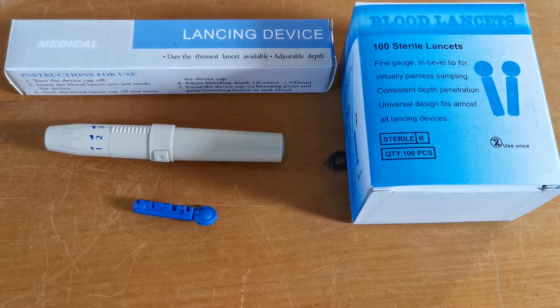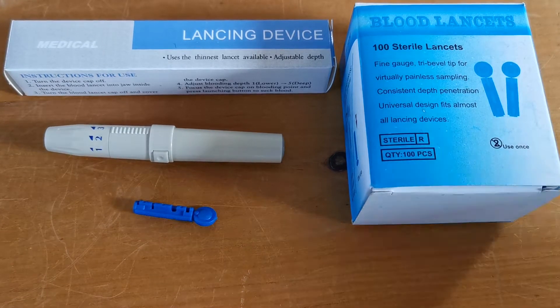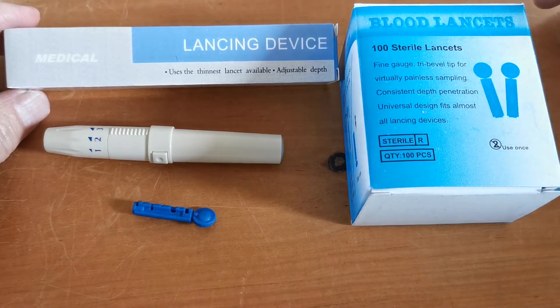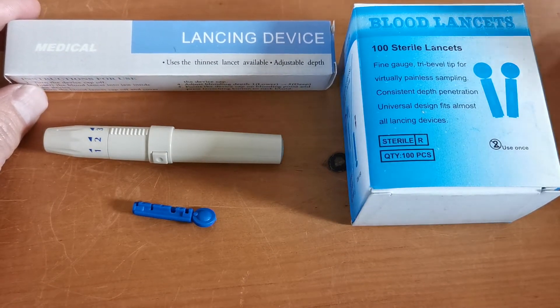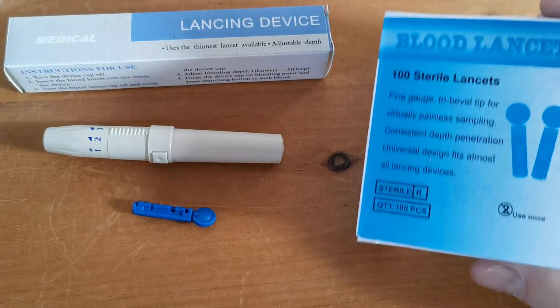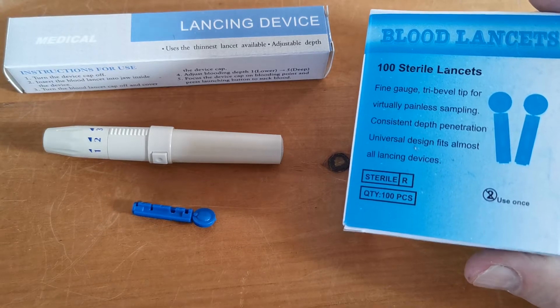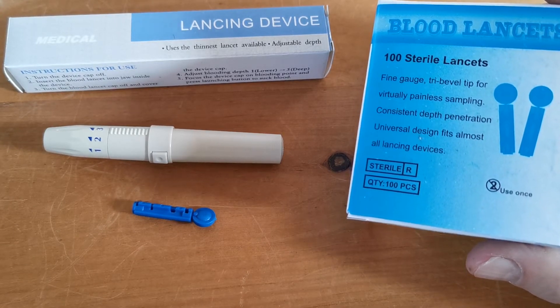Welcome to this product demonstration video. We're going to show you today this little lancing device, which is on our website as the eFast branded medical lancing device. We recommend that you use it with these blood lancets, which are 100 in a pack or 50 in a pack, sterile tip 28 gauge lancets.